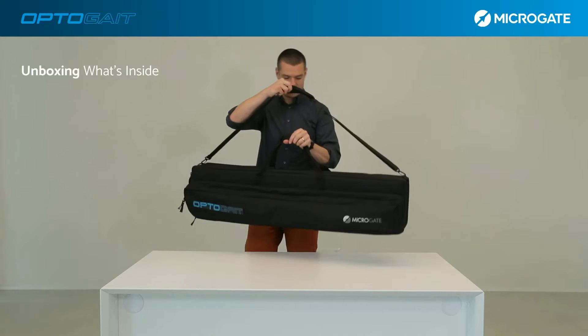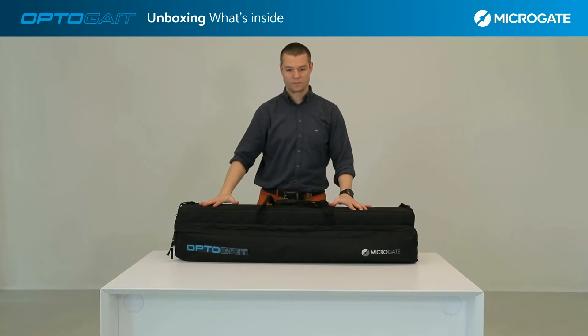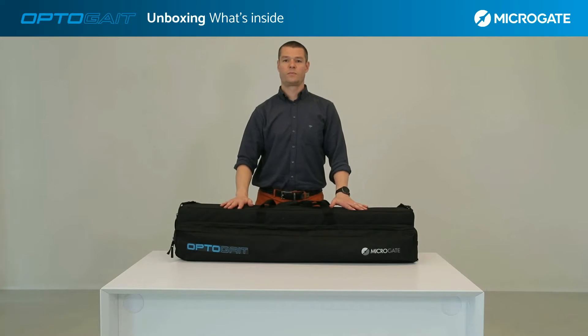The 1-meter kit consists of a bag containing the whole kit. All the accessories, as we will see in detail, are inside. The bag has a front pocket containing all the accessories and a rear compartment for the optical bars.